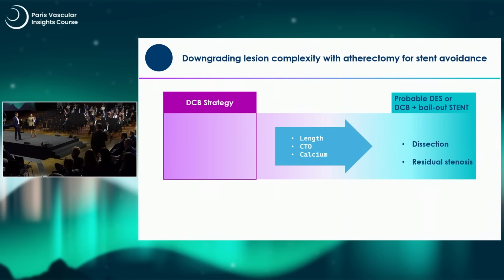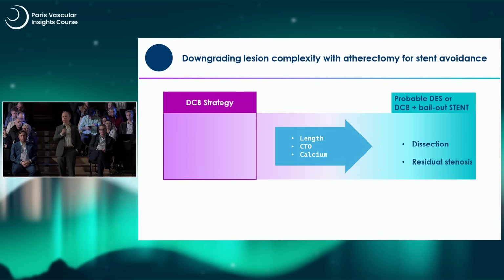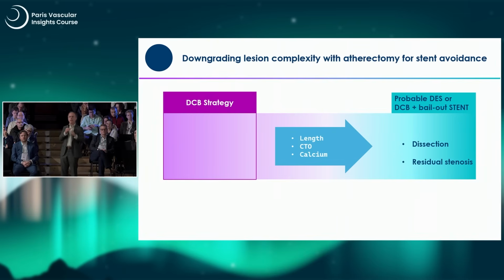So like you said, Jill, there are many ways to treat this case, and I was already a little bit confused with what Caroline was saying, and I thought first we're going to end up with a full metal jacket of stents, but then you try to avoid it. So actually, in quite challenging lesions like this, what is actually the problem with stenting?